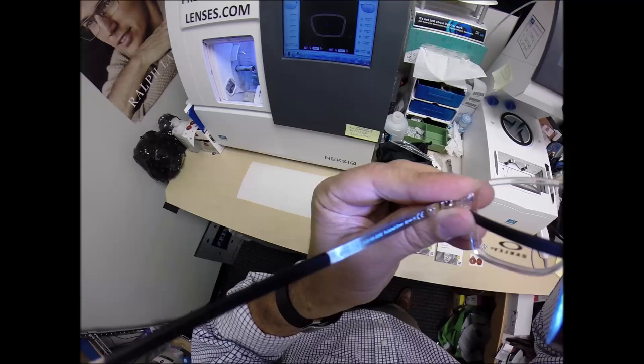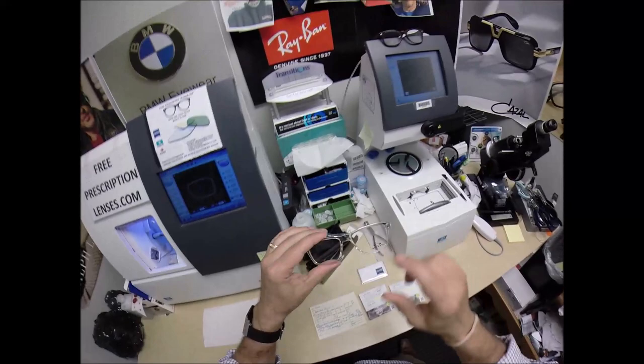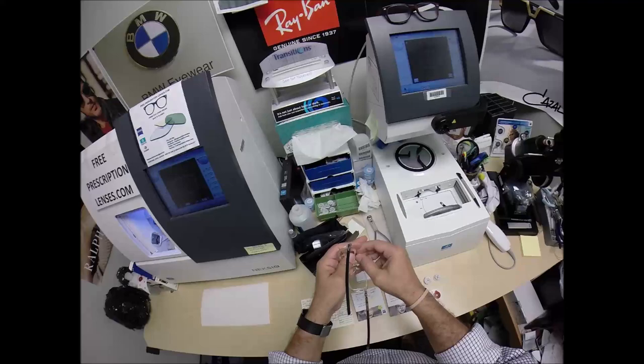Model number 8166, color 02 in size 52, polished clear. I'm going to pop out the original demo lenses so I can put your gold mirrored lenses in there. I'm going to send those original demo lenses to you as well — you get all the manufacturer's original packaging.